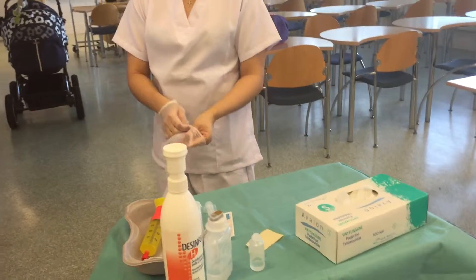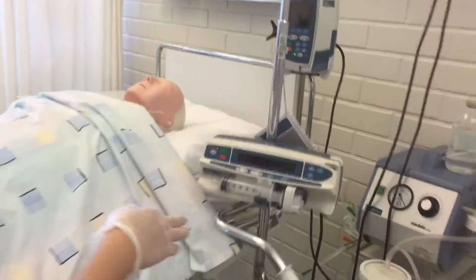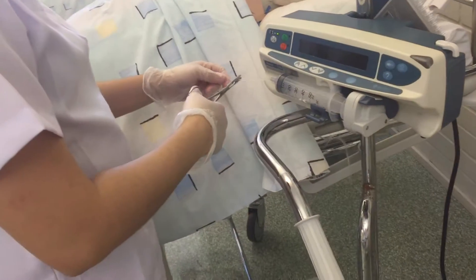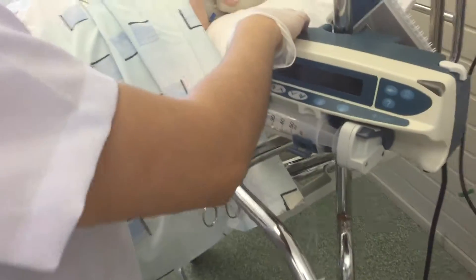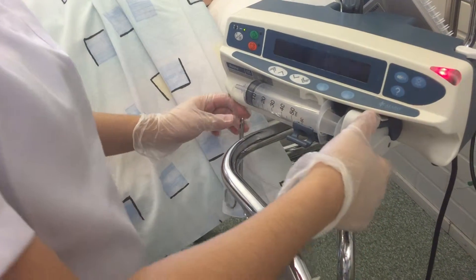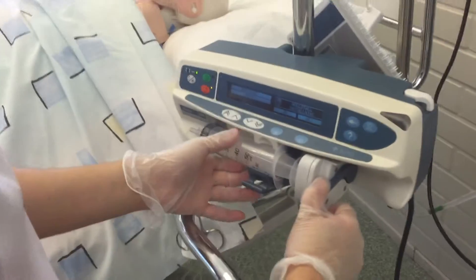Now you can go to your patient. Since the current bag is empty, first you have to clamp the line.